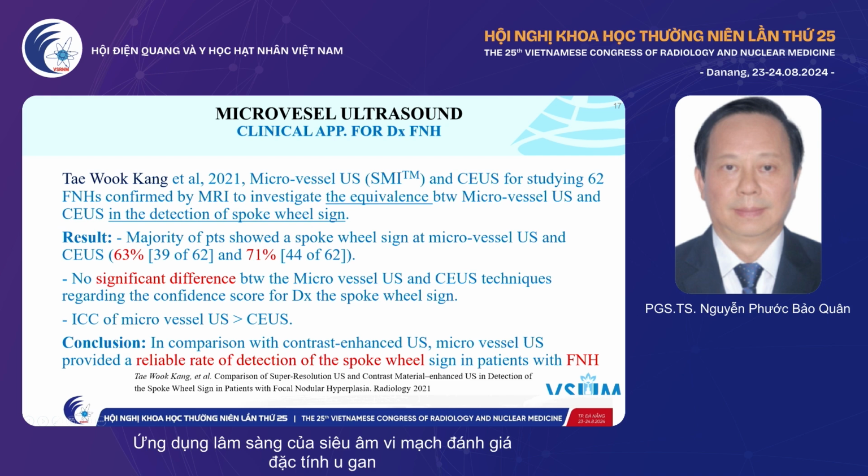And another study from Taiwan investigated FNH, focal nodular hyperplasia, confirmed by MRI, and they showed that there is no significant difference between microvascular ultrasound and contrast-enhanced ultrasound in the spoke-wheel sign to diagnose focal nodular hyperplasia.